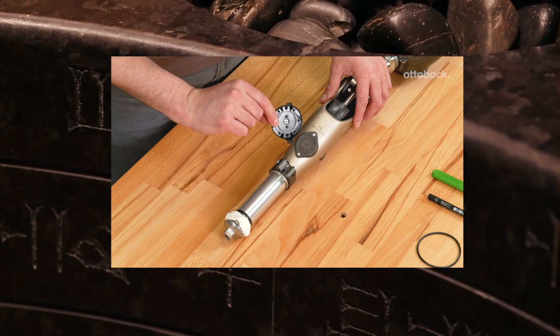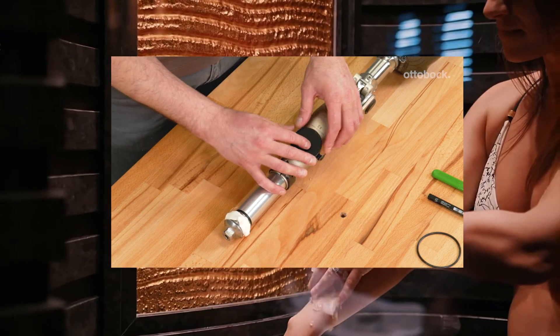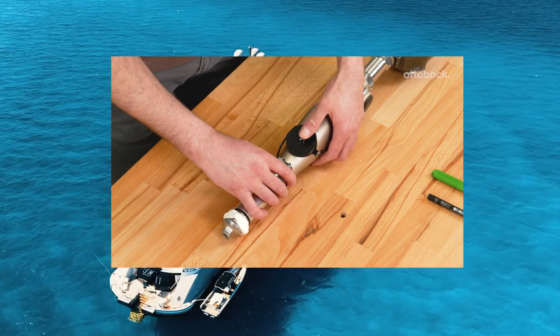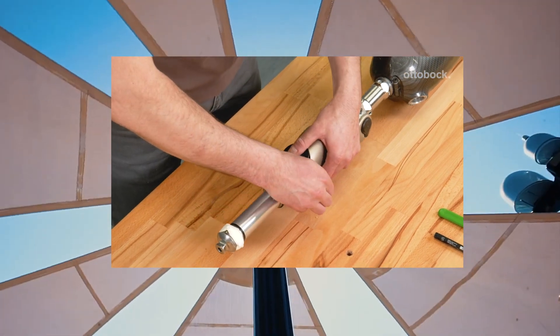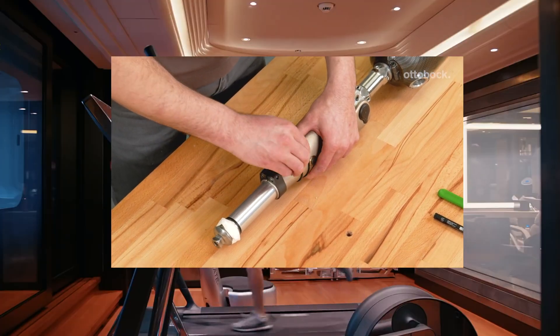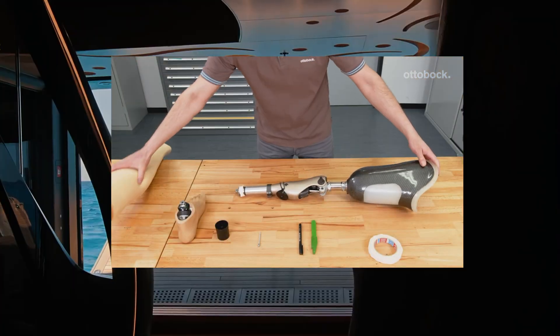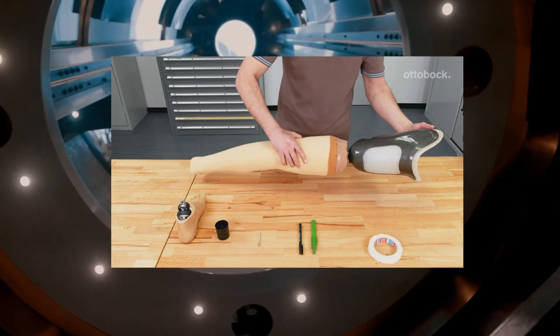Attach the centering plate to the Kenevo over the receiver of the charging unit using the O-ring, and assess the fit. Pull the foam cover over the prosthesis and mount the prosthetic foot again.